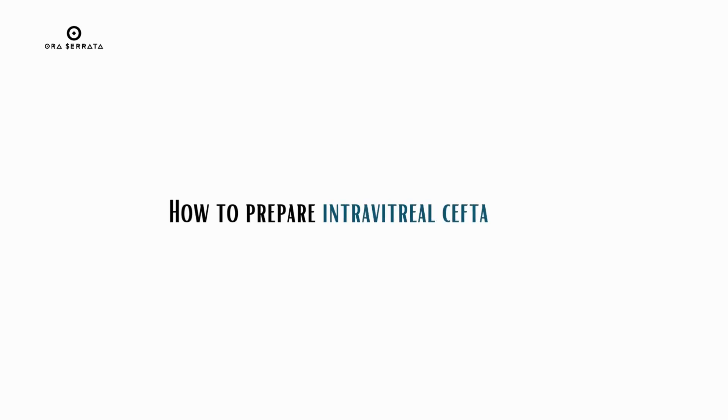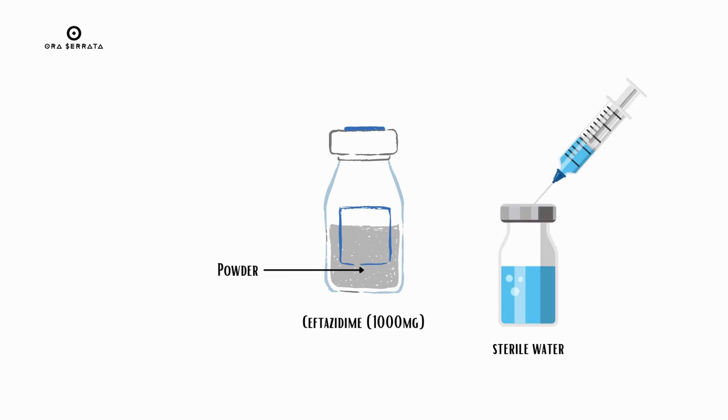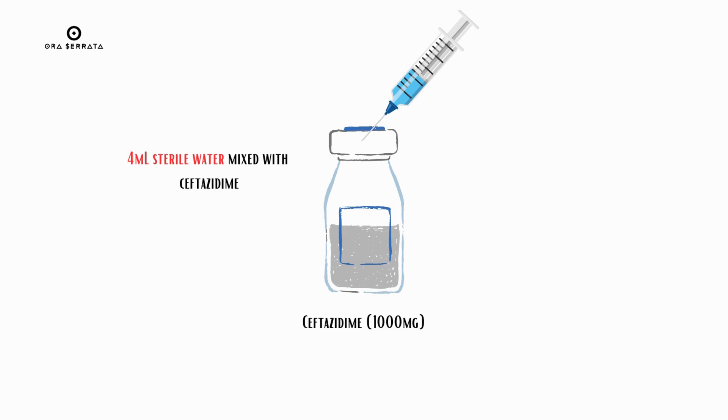How do you prepare intravitreal ceftazidime? Take ceftazidime in powdered form. Take sterile water and a 5 ml syringe. Fill up 4 ml of sterile water in the syringe, then mix the 4 ml of sterile water with the ceftazidime.